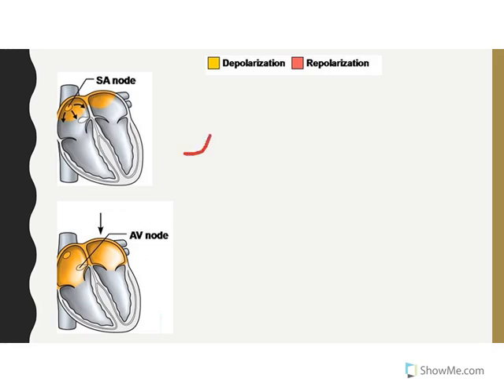Here it's starting to depolarize, still depolarizing, and coming back to baseline. The entire upwards deflection represents atrial depolarization. The peak of the P wave represents where you have maximum potential difference being recorded by the recording electrodes. As we move down here, it's still depolarizing, but there's not as much difference being recorded across the electrodes. At this point right there, the atria have finished depolarizing, and the impulse makes its way down to the AV node.